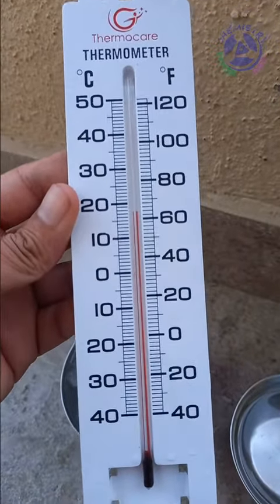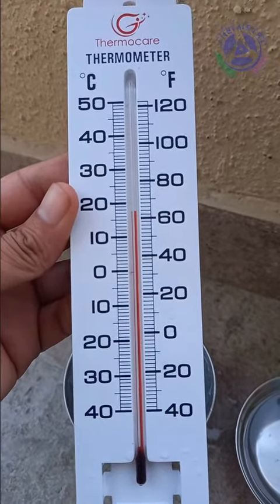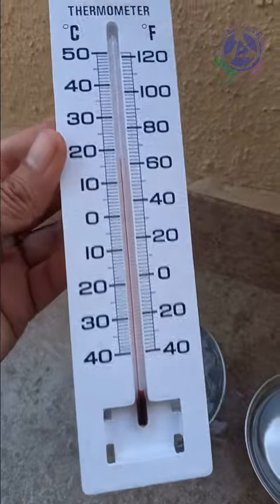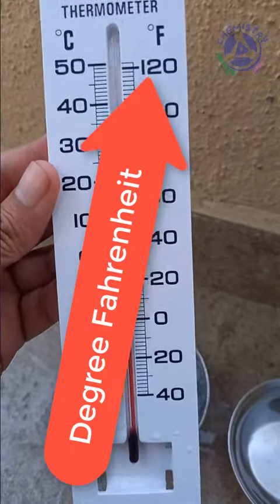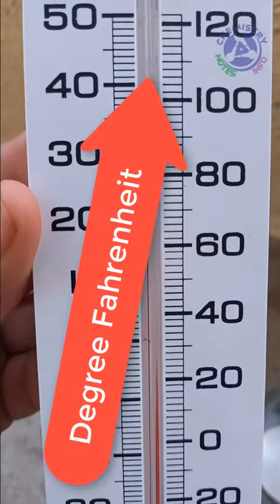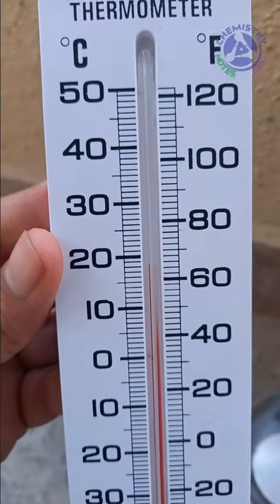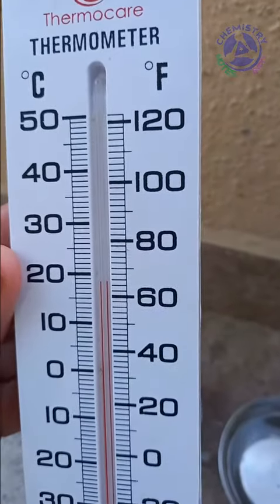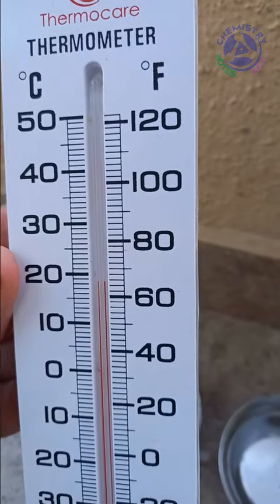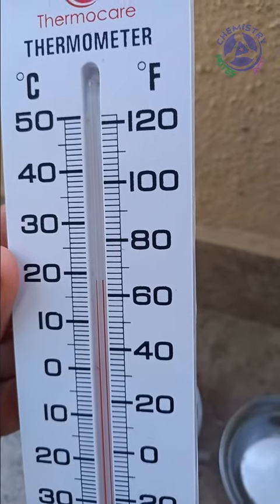This is a thermometer of Thermo Care company and it is graduated with degree Celsius and degree Fahrenheit scale. On the degree Celsius scale every tick counts for 1 degree Celsius, and on the Fahrenheit scale every tick counts for 2 degree Fahrenheit.